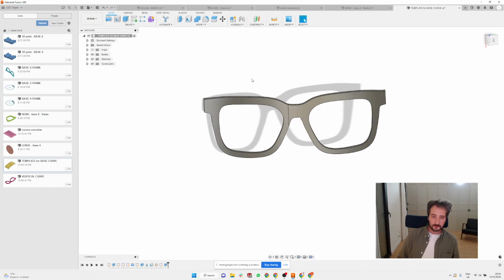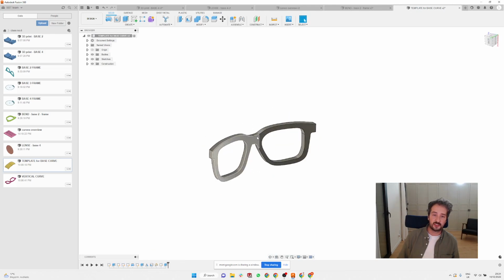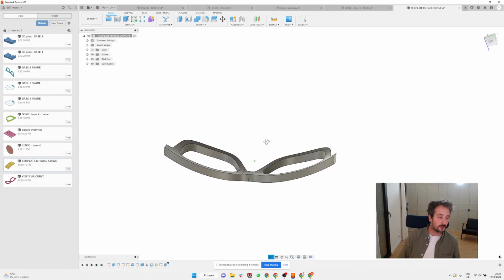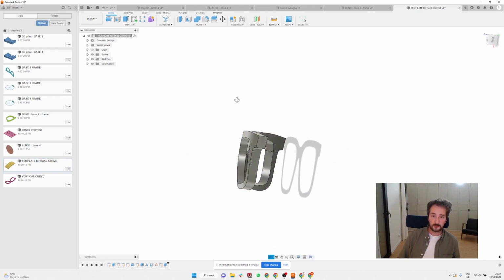So this is quite easy. If I go back and hide all this, if you have this original, you can always play with the different base curves. I wouldn't recommend using it to do more modeling on this frame once you have all this done, because it's getting quite complex to make recesses for the hinges. But it's quite good if, for example, you have a design for your frame and a 3D printer and you want to see how the frame will look, because with a 3D print it's kind of hard to bend it and play with that shape. So you can 3D print it already with this base curve and try how the frame fits and if it's maybe too small, too big, and play with that.